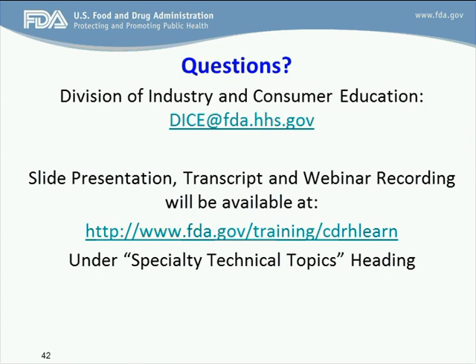Hi, this is Steve Turtel. It's really, again, this harps back towards the way the validation protocol should be designed, and that should be for worst case scenarios. So if there's any doubt that there might be accidental use or just rare occasional use of there being a contamination event occurring, the design of the validation protocols really should be put together and written in such a way that they address the worst case. So if the contamination event that may occur, it should be included really in the design of the validation protocol. Plus, that would be a good question that should go directly to the device review division.